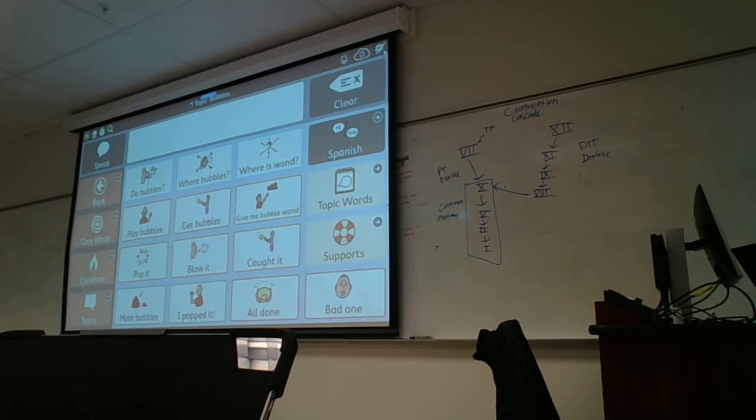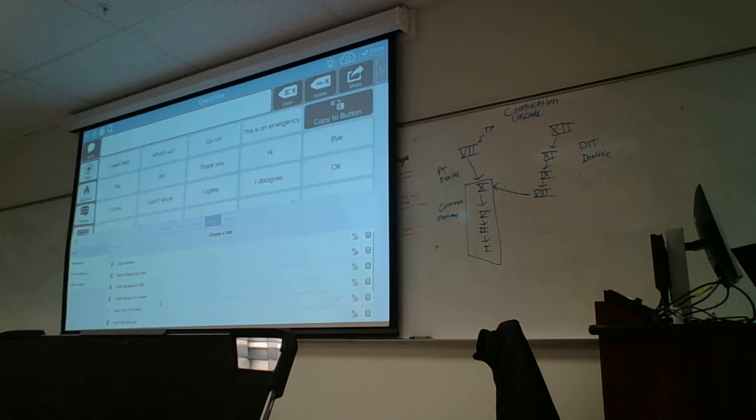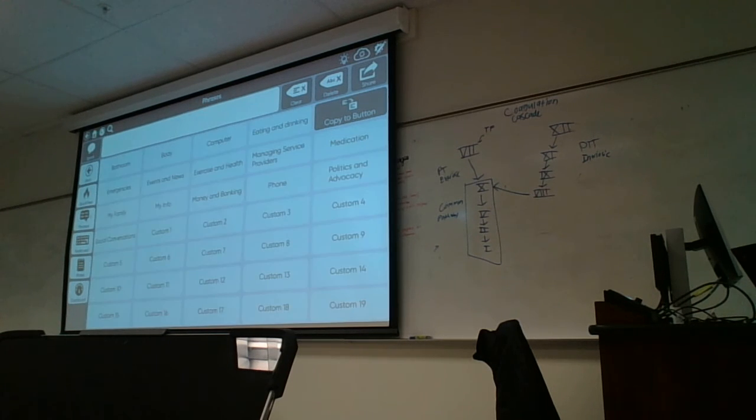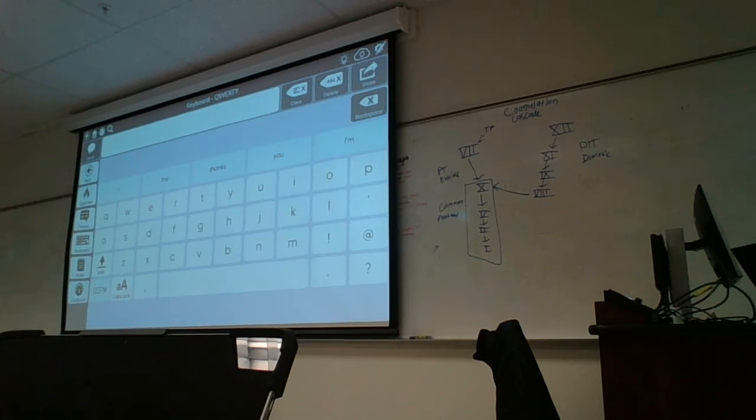And then I'll show you the other page set that I have on here, which is a text-based user. So we looked at the aphasia page sets, but this is, again, a simple, similar layout, I would say. There's that toolbar on the side. It is a 7x10 grid size on here. Again, there are some messages, there are different categories, but it's all text-based. And you can program these and make them more personalized to the user as needed. And there's things like the keyboard within here as well. So it kind of depends.